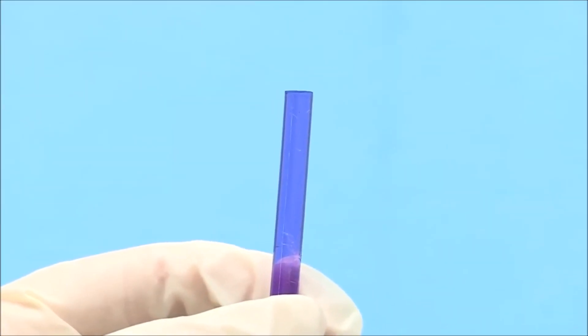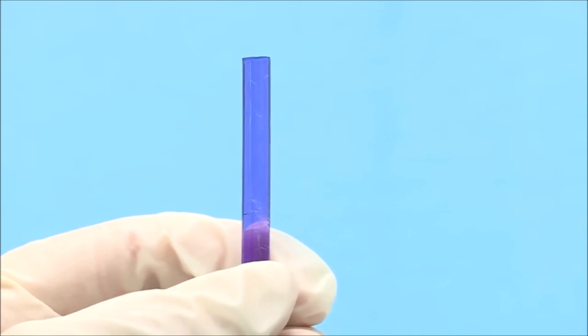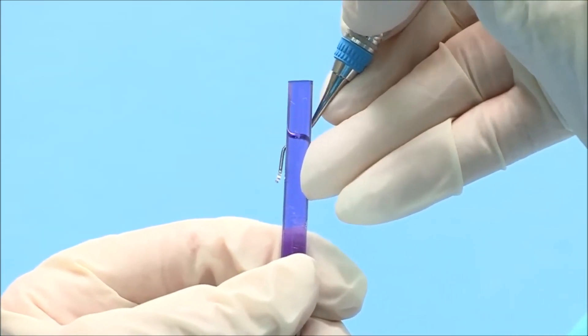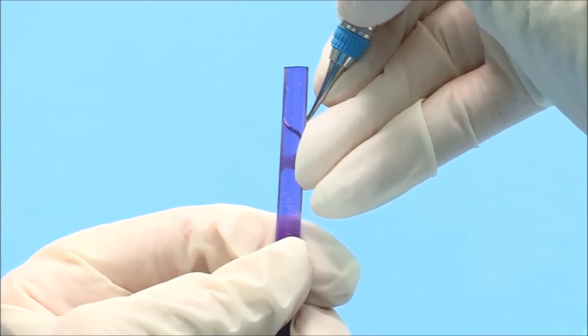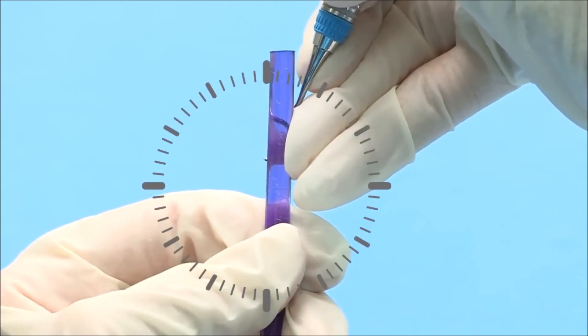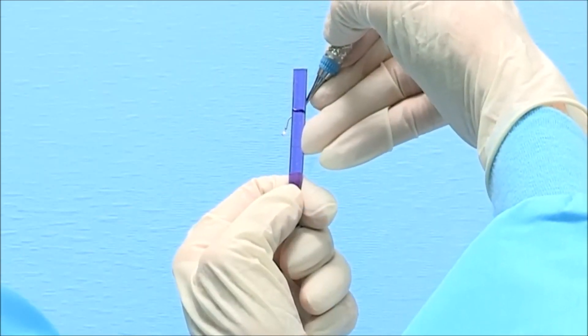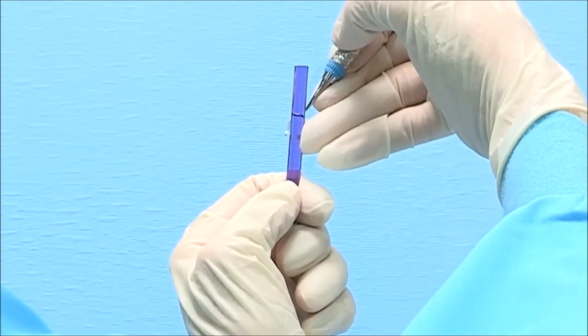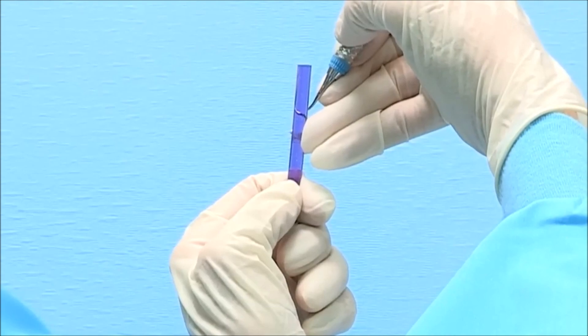Testing Gracie Curettes for sharpness is extremely easy because the downward slope of the blade automatically positions the cutting edge at the correct position on the test stick. The position for the terminal shank of the Gracie Curette and the test stick will both be at 12 o'clock. In your dominant hand, hold the instrument with a modified pen grasp. For odd-numbered working ends, the toe will be pointed toward you.